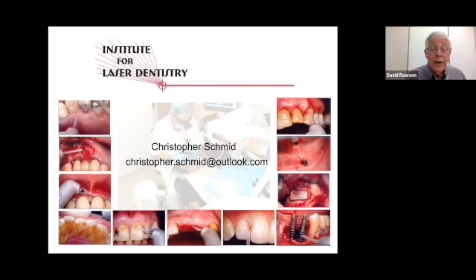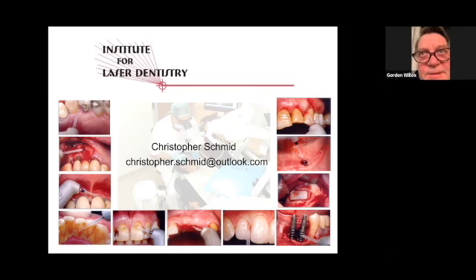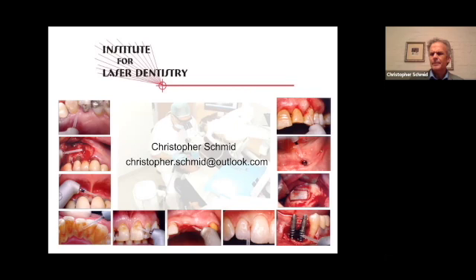Right. Thank you. We now have a raised hand from Dr. Paul Alter. So there was a lot to follow, and I've been interested in lasers for a long time, but just couldn't find anybody around who could teach it. So I'm surprised I didn't come across you folks. So what's the wavelength of this laser? 10,600 nanometers. It's the same laser that the dermatologists and plastic surgeons use, and we've been using it in dentistry for a long time.